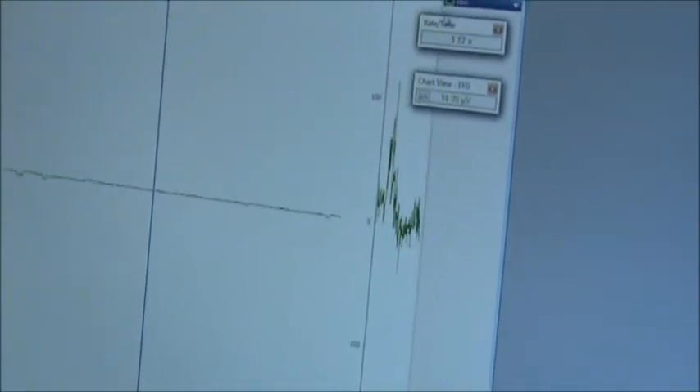If you'd like, we can also change the gain setting which is up here at the top, making it larger and more visible. We can make a higher gain to see more changes, or a lower gain so that it's a little more consistent.